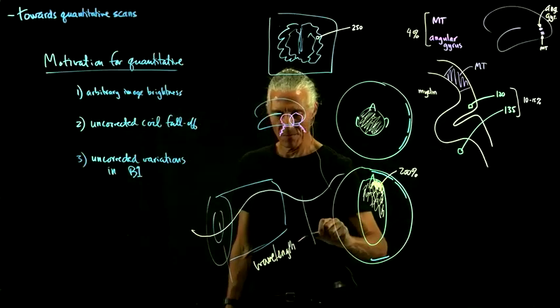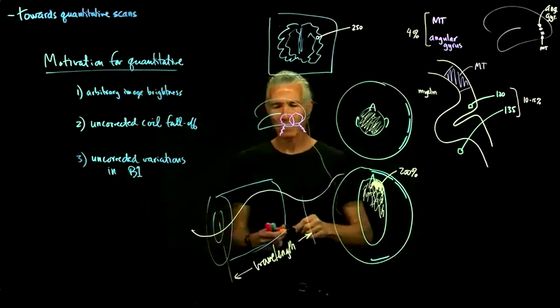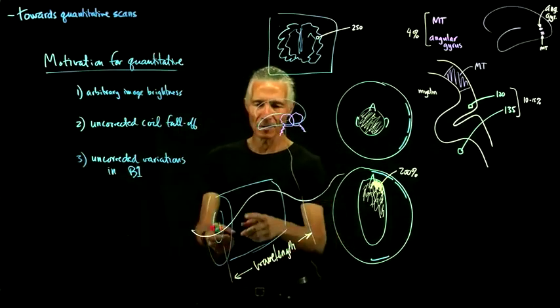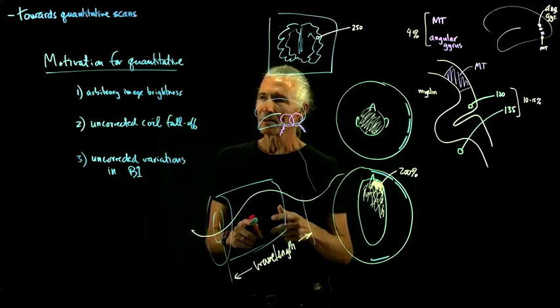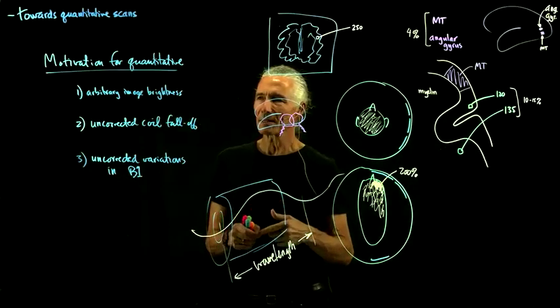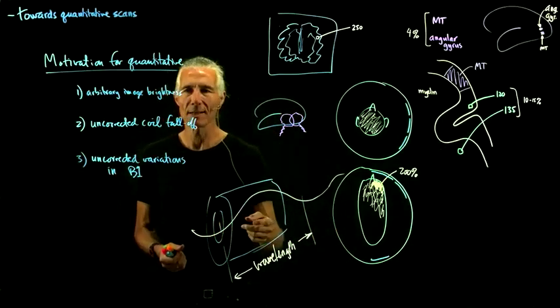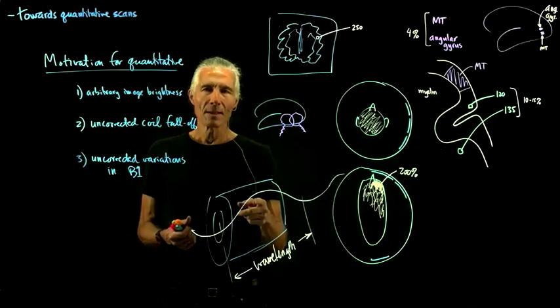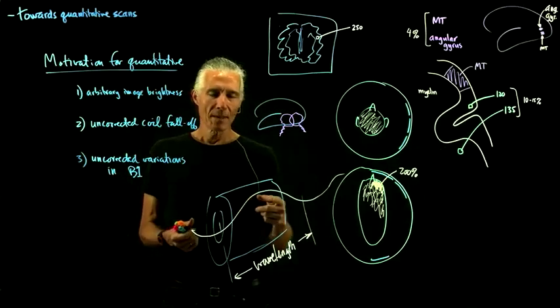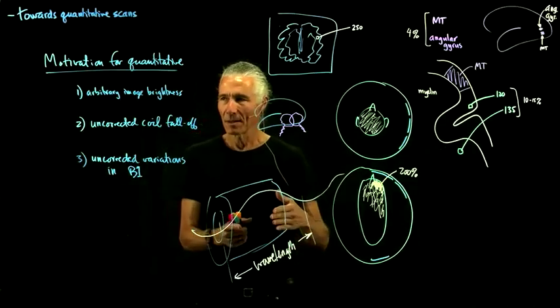If you go up to higher, it's a little bit bigger than that, but it's like a meter or something like that. So if you go up to higher frequencies, the frequency is exactly proportional to the Tesla, from our very first equation. So if you double the Tesla, you double the frequency.